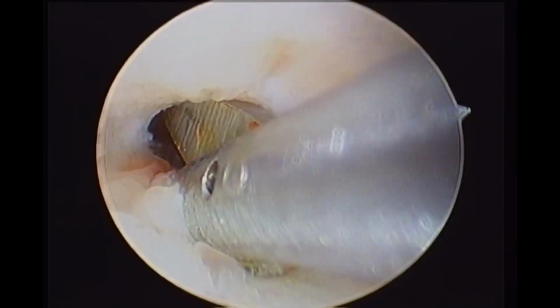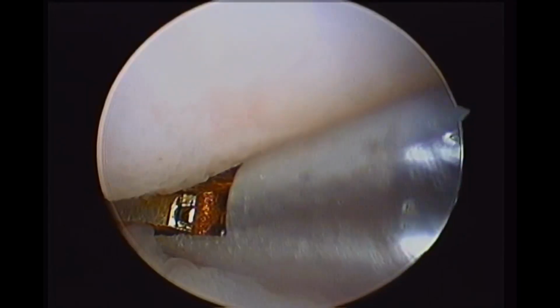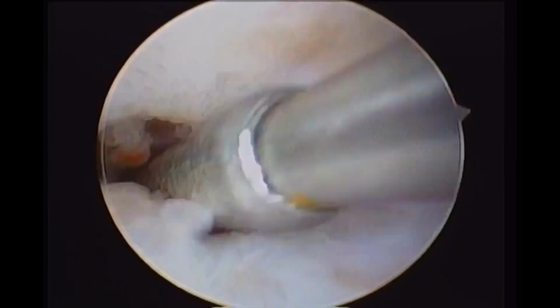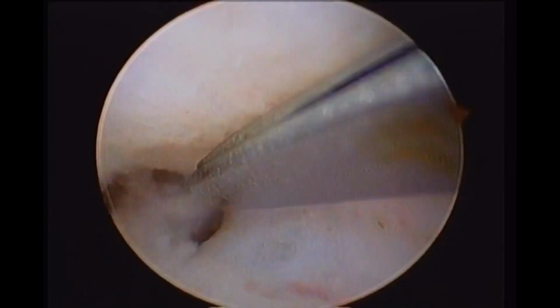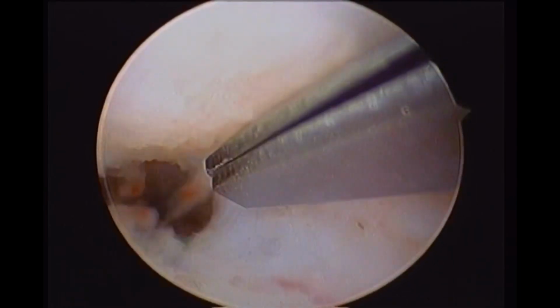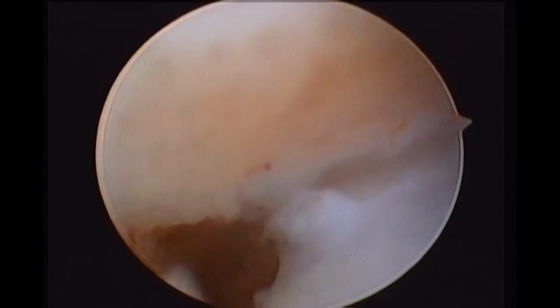Actually, in endoscopic surgery, you don't have the pleasure to touch the tissues with your hand. So what they call experience, which develops over time, is that you can get the transmitted sensation from the instrument, from the scissors to your nerves and your hands and your muscles. So here I'm continuously using the scissors, opening the blades to widen the opening, taking little snip cuts at 3 and 9 o'clock to allow insertion of the hysteroscope. Now let's push and go in.